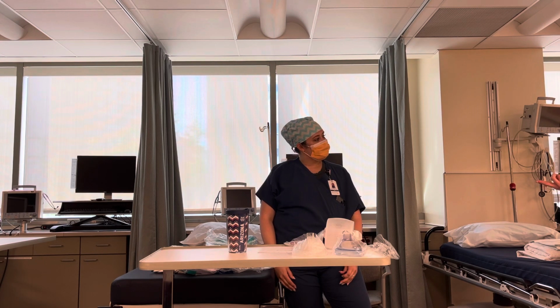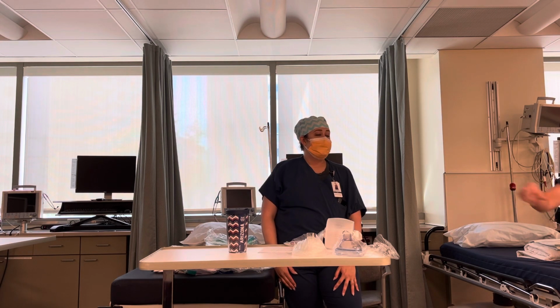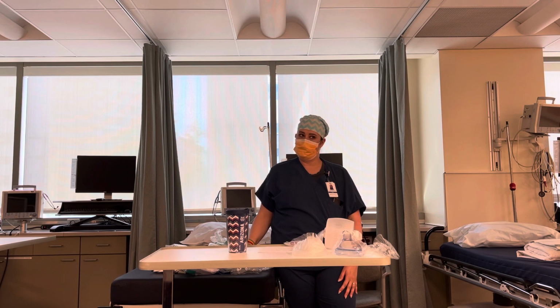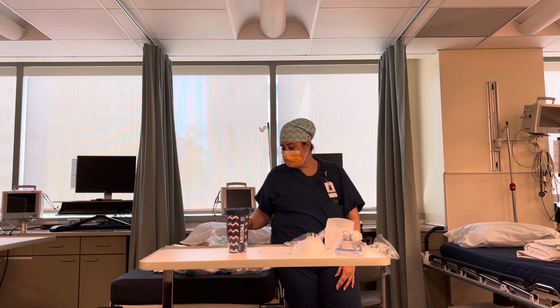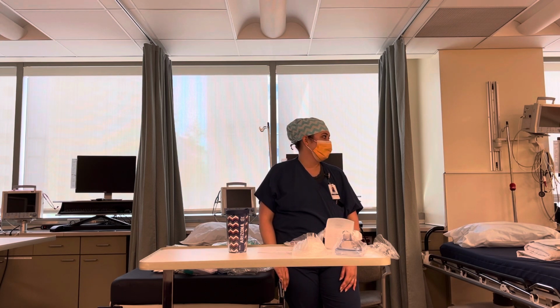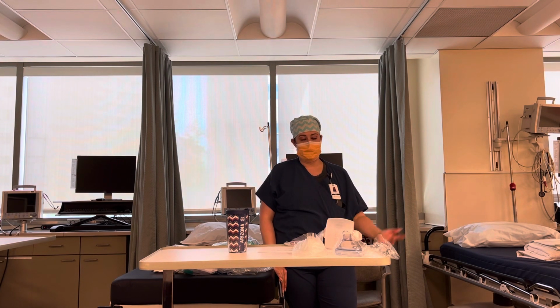Is there a spot out here where that is kept? So say it happens in recovery. An ambu bag? The Jackson Rees, no, and honestly, you guys probably would just be more comfortable throwing on a non-rebreather or doing an ambu until we got out here, because it takes some finesse and practice to know how to adjust this valve, and I don't think we need to get into teaching you guys that. Just use your normal airway stuff, and then of course one of us will be trying to get out to help as soon as we can.